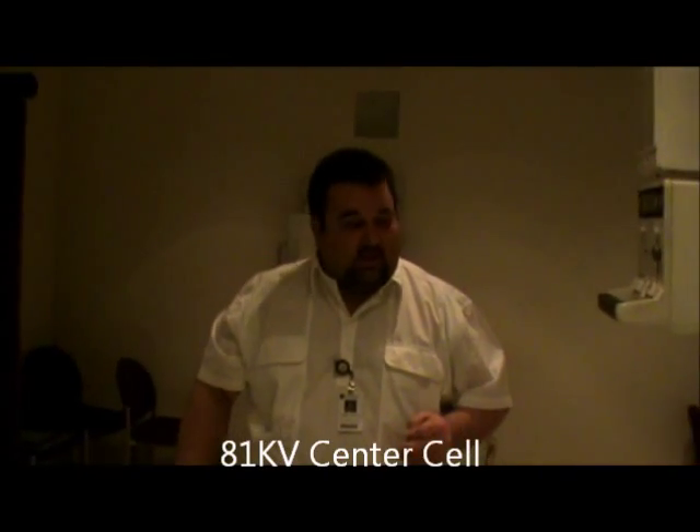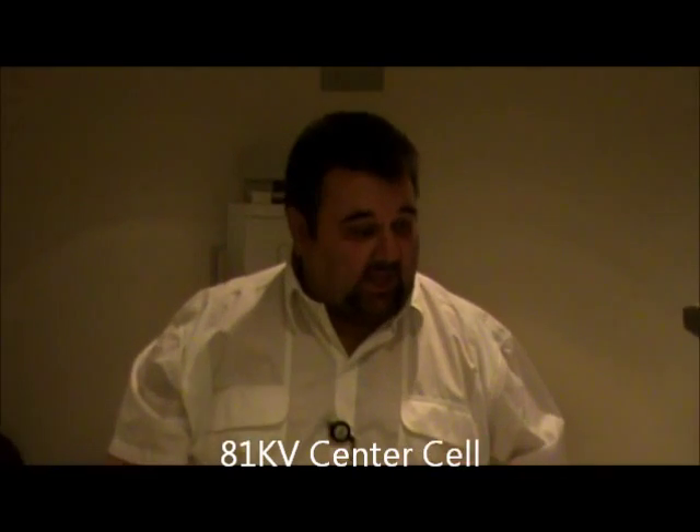I'm going to put my marker placement to either side, either corner, is fine here. The technique, again, is going to be 81 kV, center cell. And we're looking, again, at the upside SI joint.